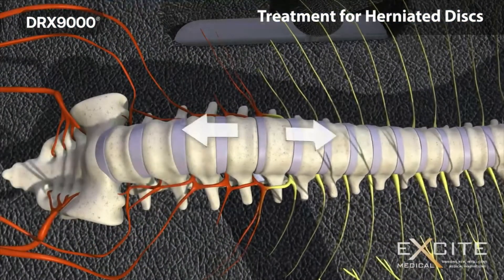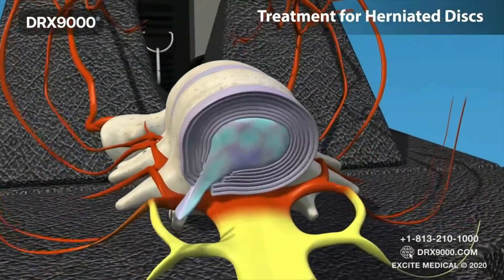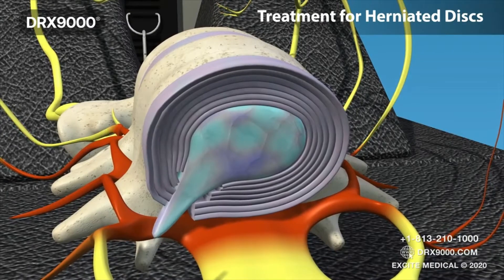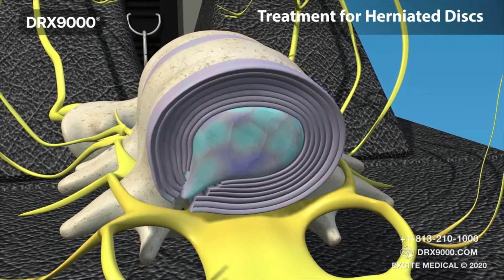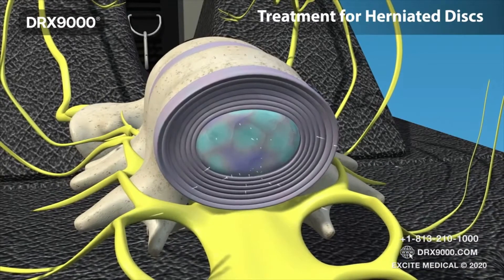Similarly, in cases of herniated discs, the jelly-like nucleus comes back to the centre. As a result, it takes pressure off of the impacted nerve roots, relieving patients of their related symptoms. These results have been proven in pre and post studies.